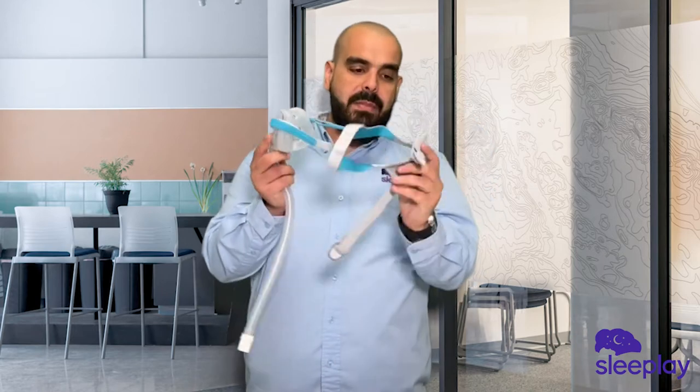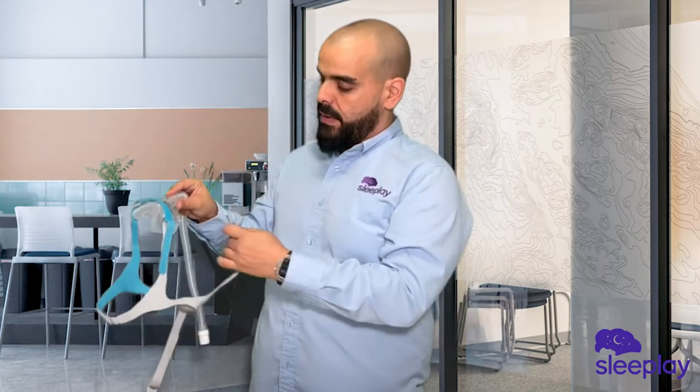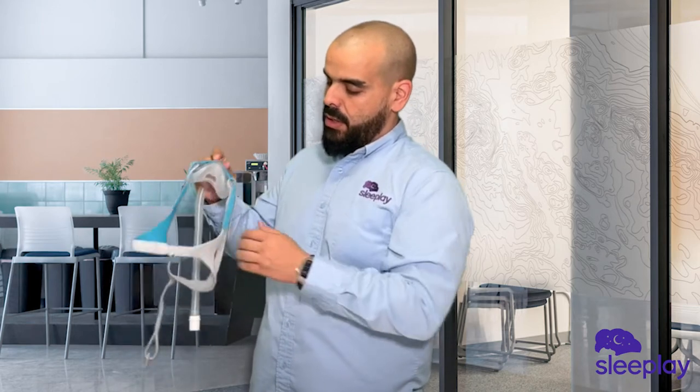The headgear goes to the back of the head and it has a breathable headgear. On the front it's going to have clips that just hook on.